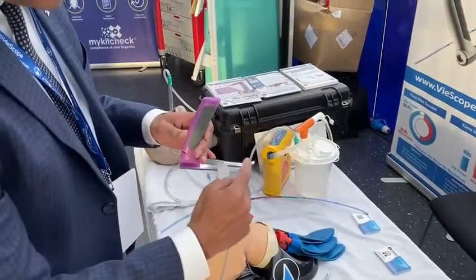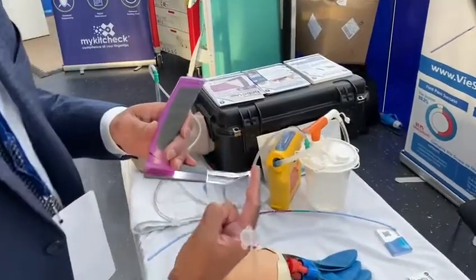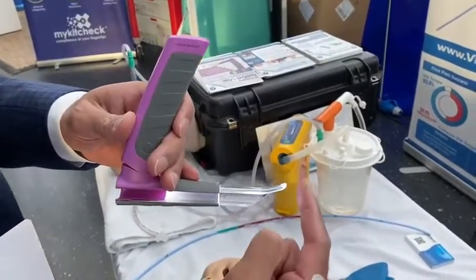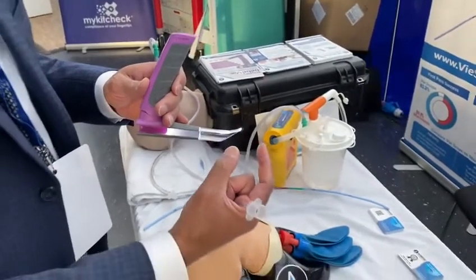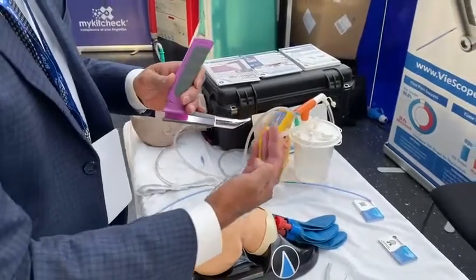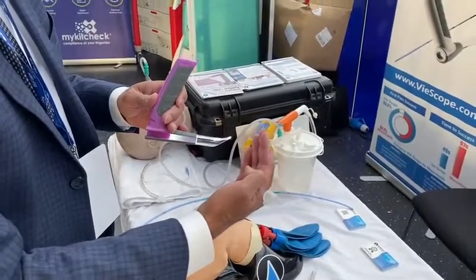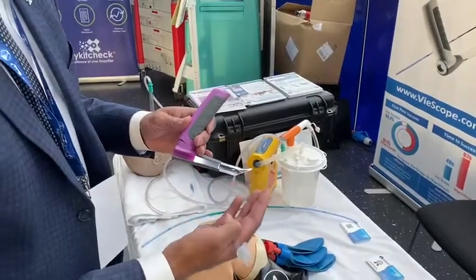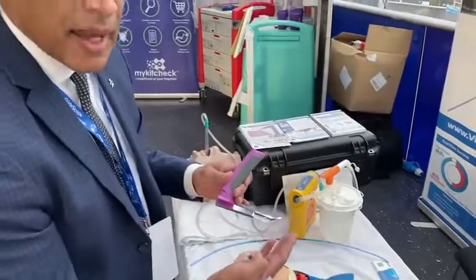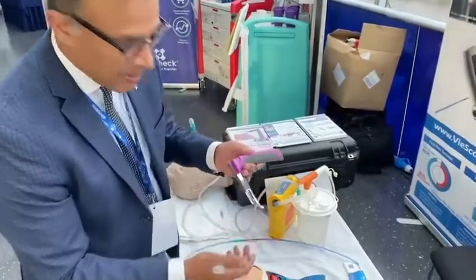The blade is a specific design so you can use it like a Macintosh or a Miller. The blade can be placed in a patient who has a short, stubby epiglottis to elevate the hyoepiglottic ligament and elevate the epiglottis. But if they've got an elongated epiglottis or a floppy omega-shaped epiglottis, you can use it like a Miller blade.